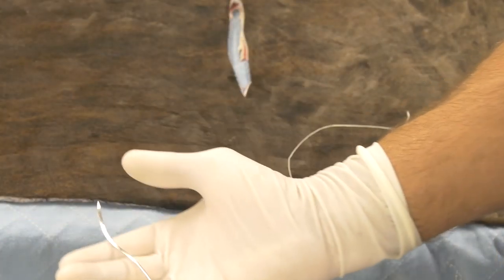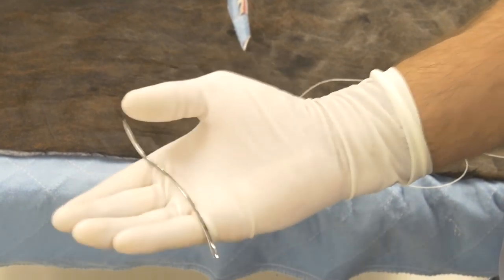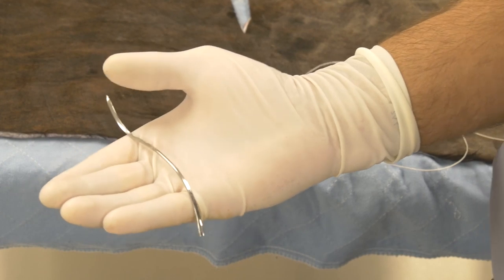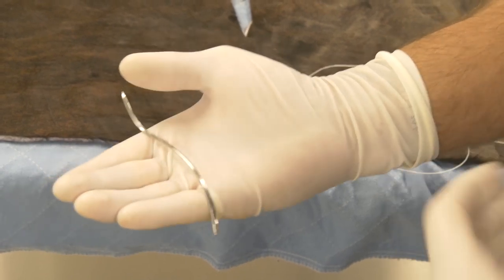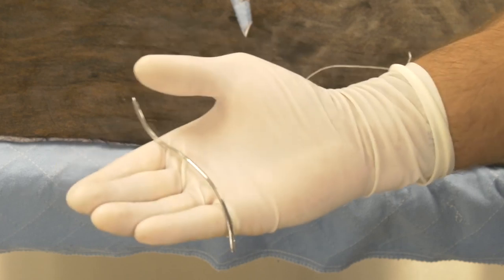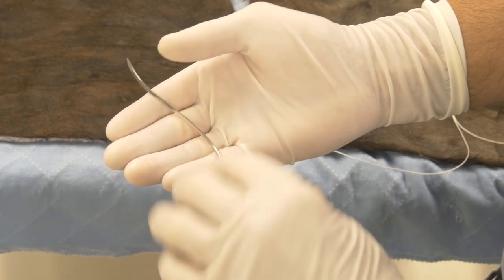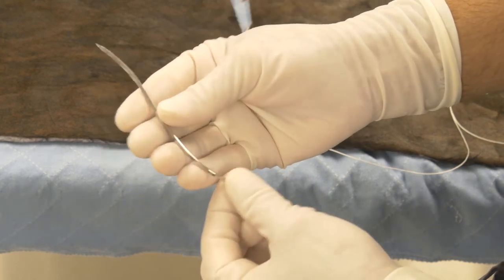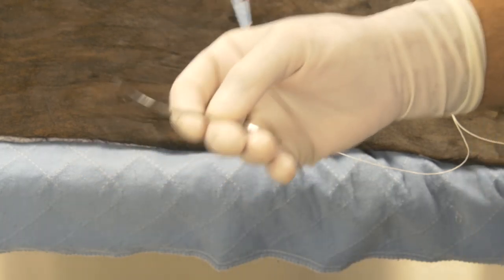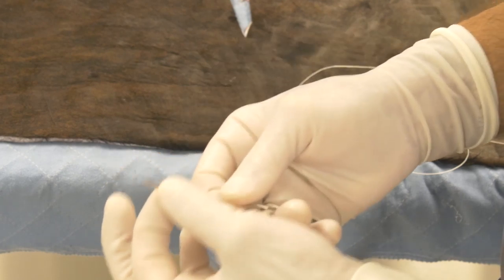This is our S-curve needle, and this is a handheld needle. The nice thing about this is we do not need a separate instrument or needle driver to push this needle through the skin — it will be done completely using our hands. It does have an S-shape, hence the name S-curve needle. One very important property, essential for passage through thick bovine skin, is that it's a cutting needle.